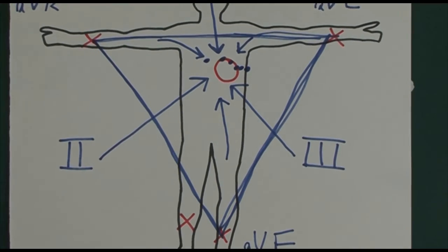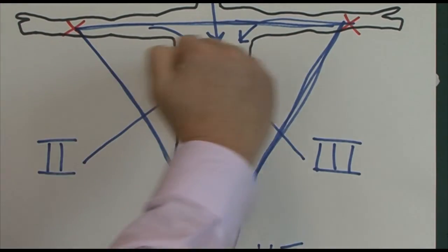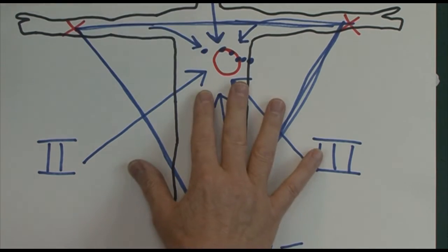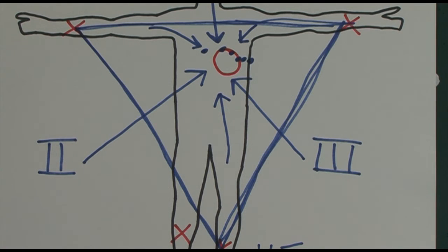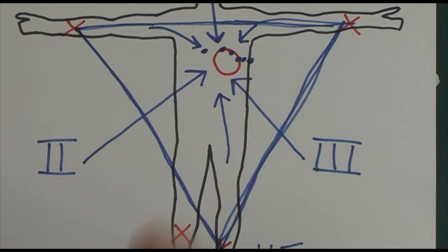And these are looking at the heart from a plane going around the heart that way. So these ones are looking at the heart in this, the 1, 2, 3, AVR, AVL, AVF looking at the heart in this direction, in this plane. The chest electrodes, V1, 2, 3, 4, 5 and 6, are looking at it in this plane. So we've got a lot of positional information about the heart here.